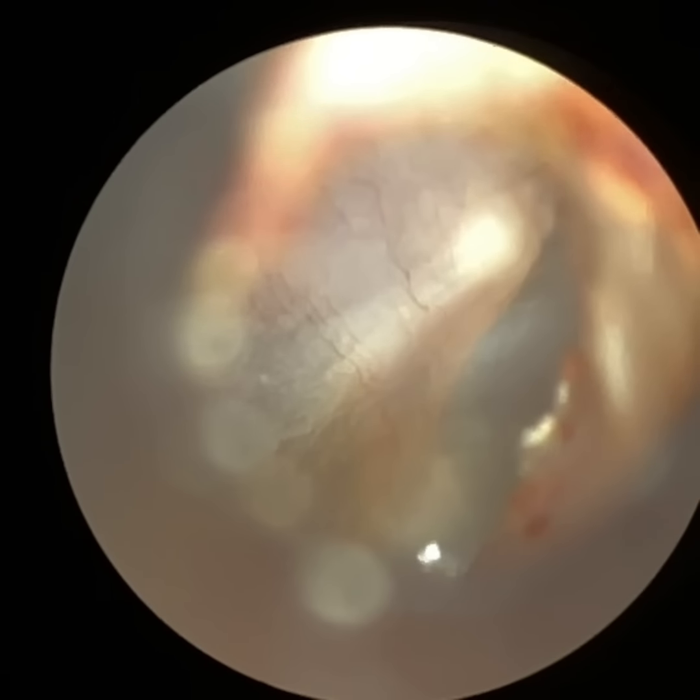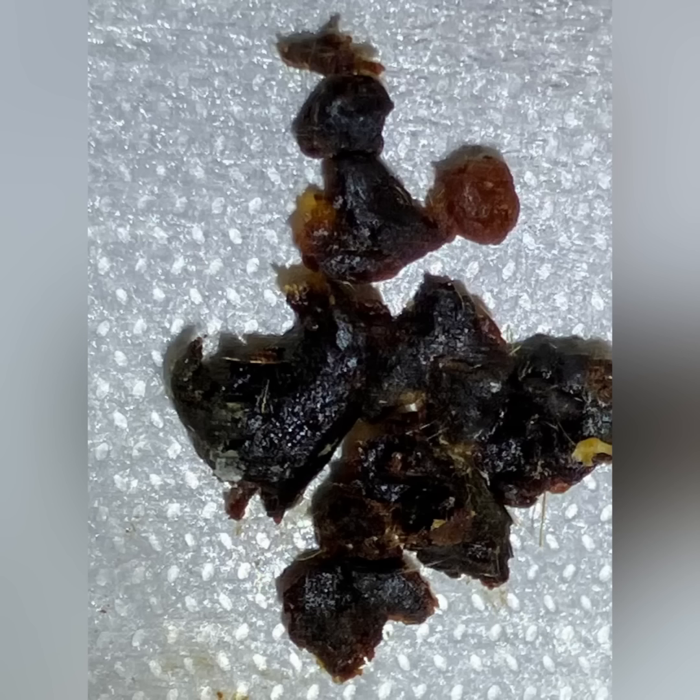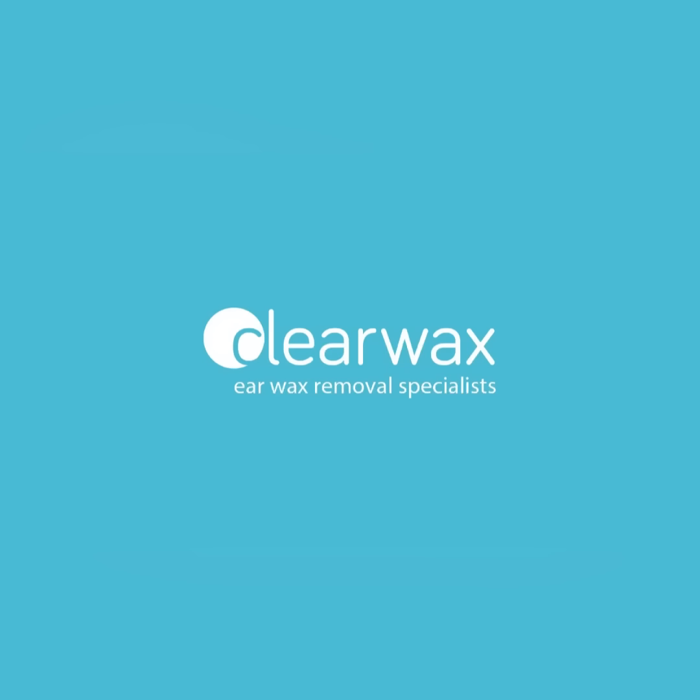We've just removed that wax from the anterior canal wall. Getting the eardrum in focus — it all looks well. And you're going to see all the wax that I removed — it looks pitch black, as you can see. I hope you enjoyed that video. If you are interested in the WaxScape, please do email info@clearwax.co.uk. Thank you, bye.